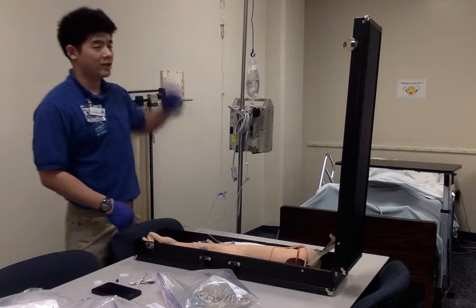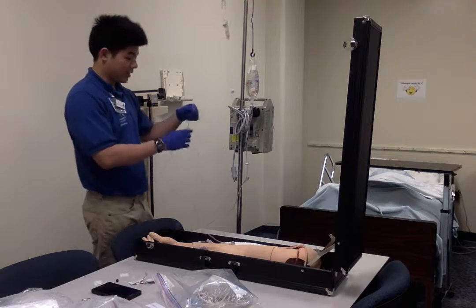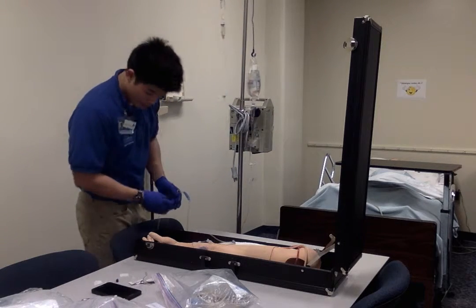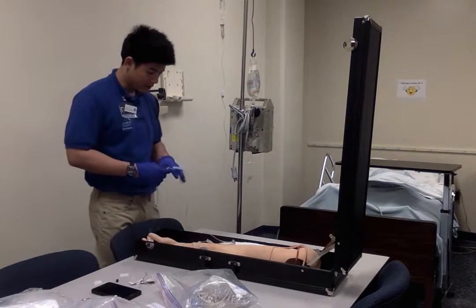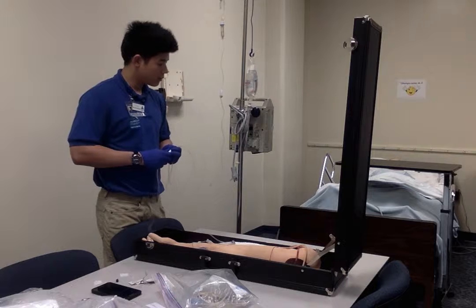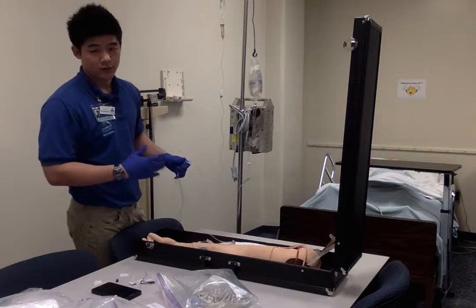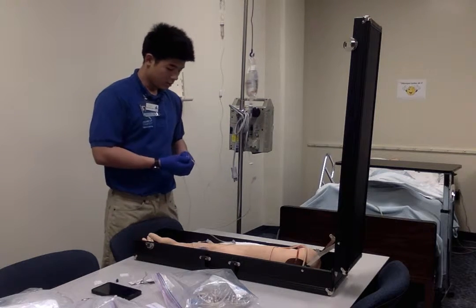I come back and I see the medication is done. So what I'm going to do is do my hand hygiene, put my gloves on, and stop this flow, the piggyback. So you can take this off. I'm going to check one more time for any signs of infiltration or phlebitis. I don't see it. Okay, so I'm going to have to reestablish the flow rate. Unlock it. Okay, and I would of course do this as how it was flowing before. Okay, so this is good.